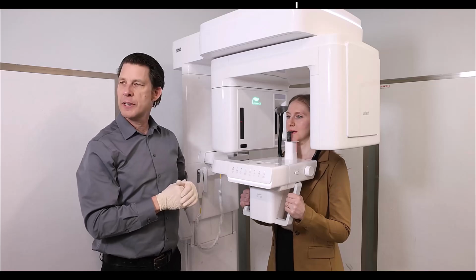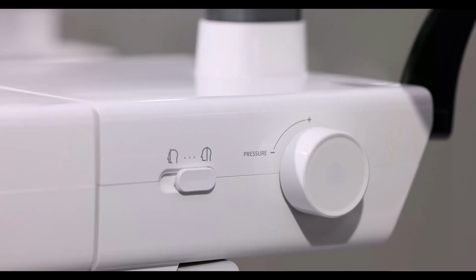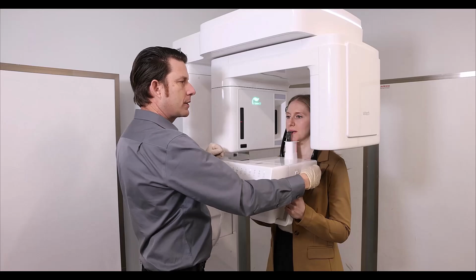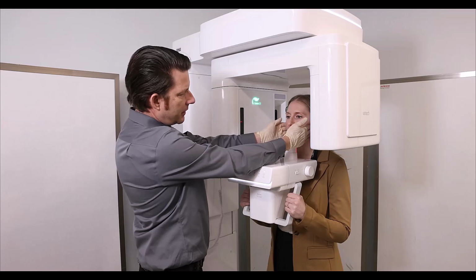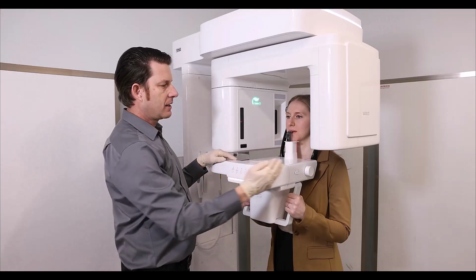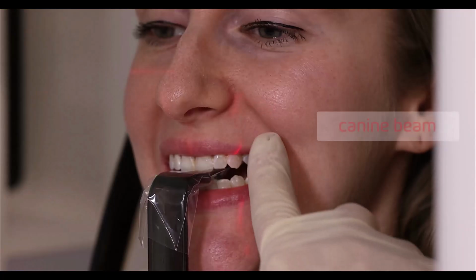My next step is going to be to close our temple supports. I use the wheel on the side here, and you'll see that they go ahead and touch the patient's head. I'm going to give them about a half turn more to make sure that they are snug so the patient does not move. I always go back through and just double check the mid-sagittal beam just to make sure they're lined up center. And then lastly, have the patient smile really big. You can see here I'm moving the canine beam anterior posterior to get that lined up right through the center of the canine.